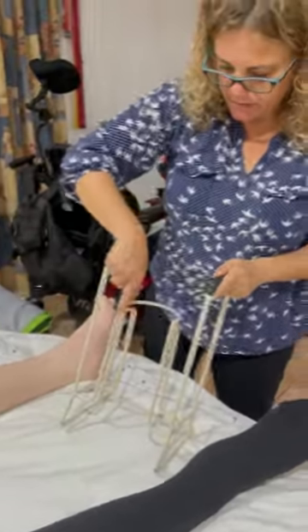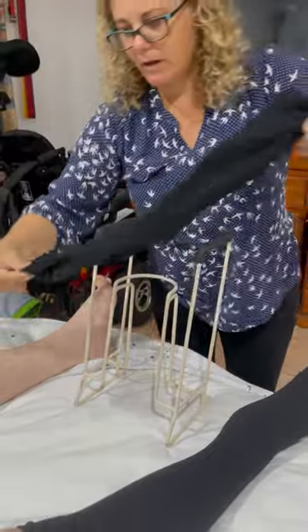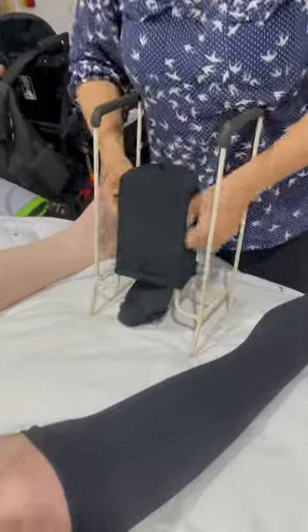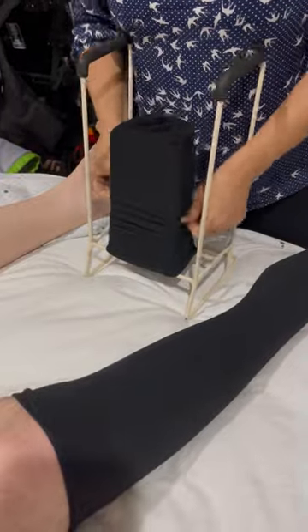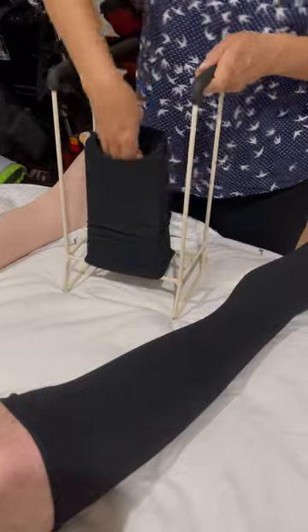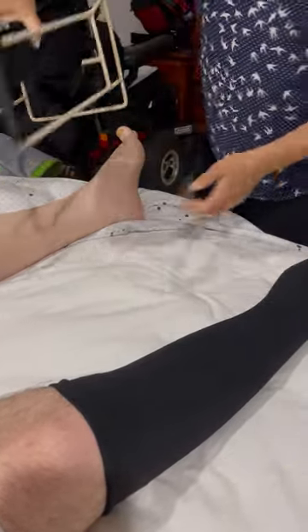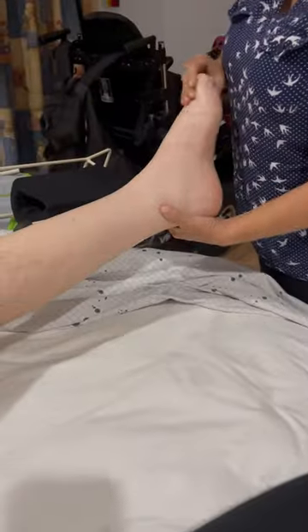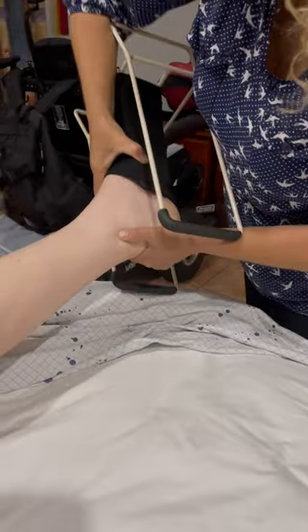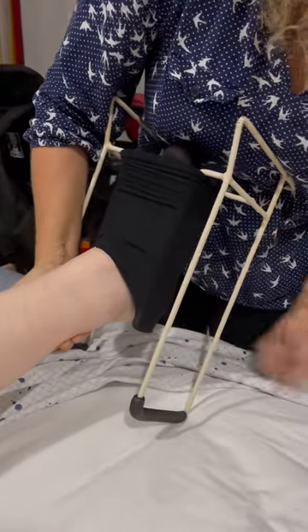Sit it up this way so the little bar is facing you, heel to the back — slide it over all the way. You can correct the position once you've got to the toes. Push the toes in a bit, make sure the heel is in the right spot. Turn it around — this little toe bends a lot, so just make sure you don't bend it back any further.